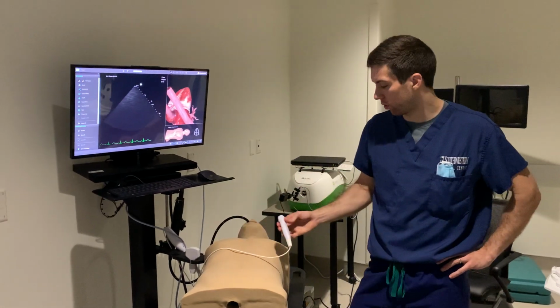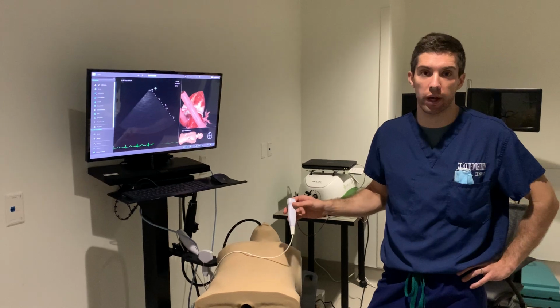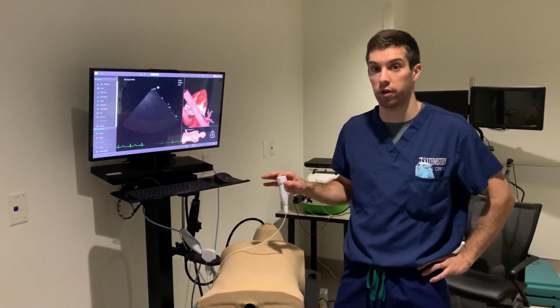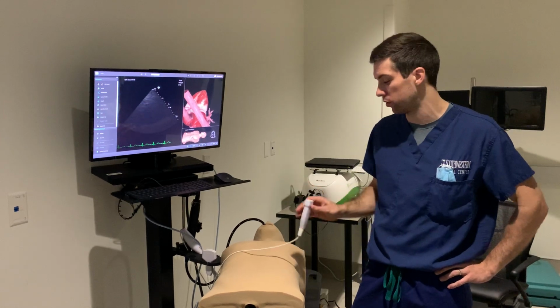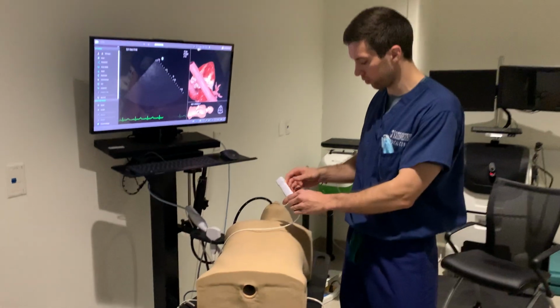Okay, hey everybody, so we're back. We just got finished doing the parasternal long axis view and the parasternal short axis view. So now we're going to do our next one, which is the third of our 4 views, the apical 4 chamber. So again, we have our ultrasound probe here.